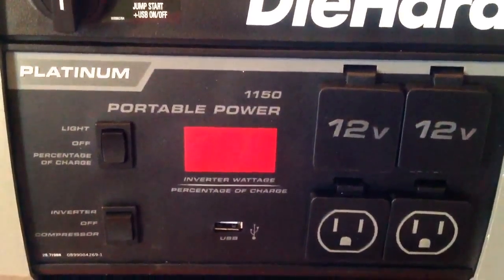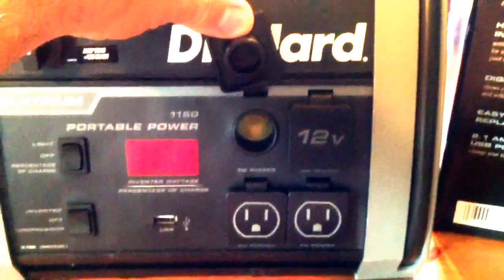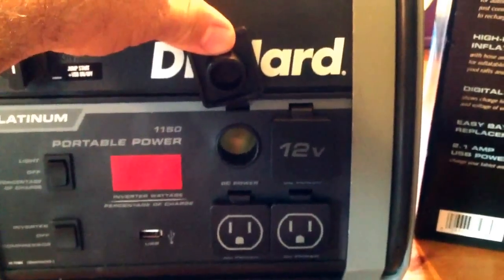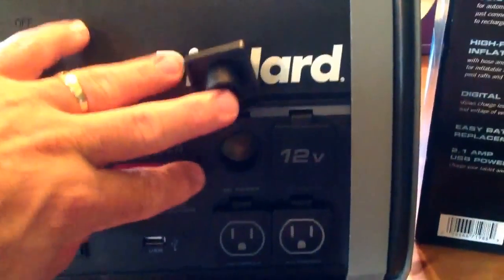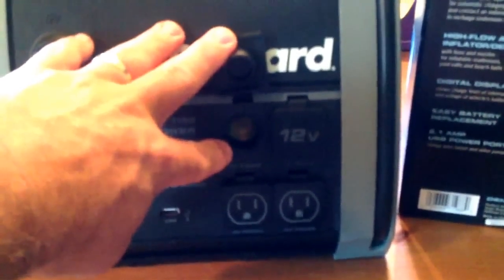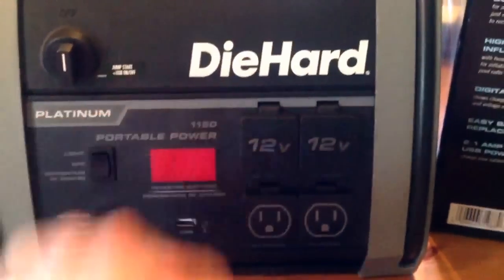So again, I wouldn't think that this thing is going to keep me going for a couple days in a mountain cabin somewhere without recharging it. That's a little bit unrealistic to think of this device. Okay, so there's my 12 volt jack over there. And I could plug in a cable from here to my cigarette lighter. That also looks like a cigarette lighter too, so it's like a double jack that you would plug into your cigarette lighter, one into there, one into here.